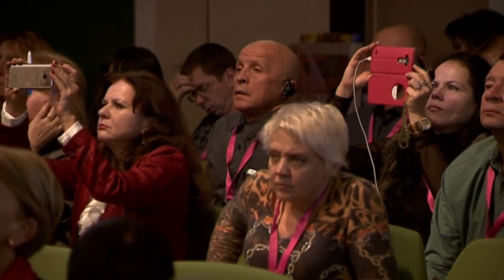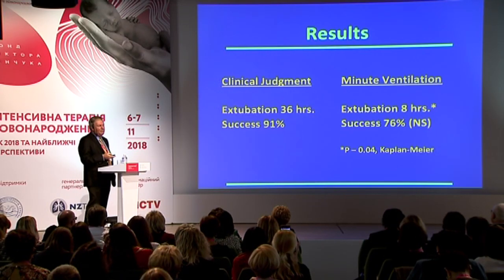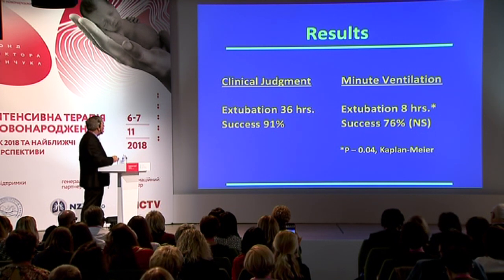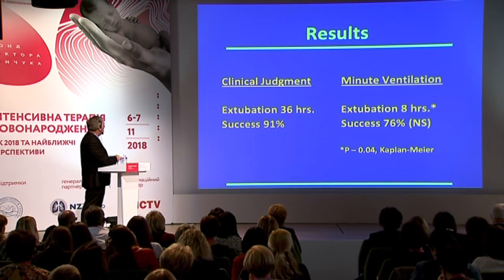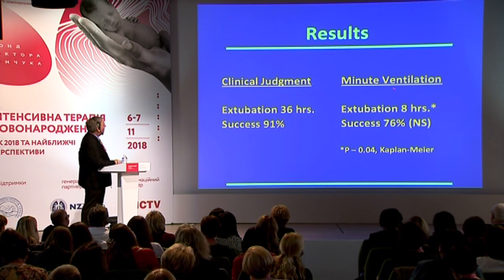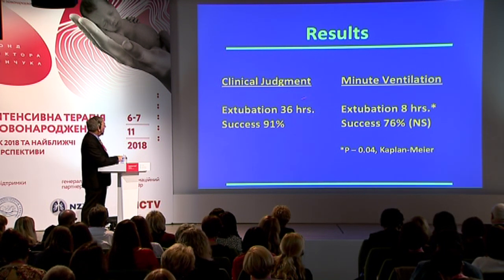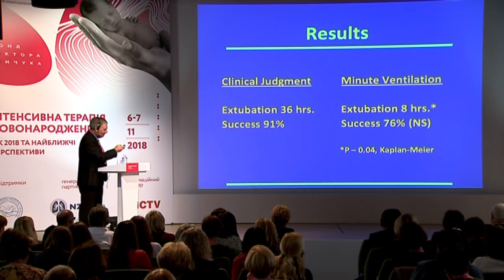And here were the results, that waiting for clinical judgment, in other words, you feel like the baby is ready for extubation, took 36 hours. Had a good success rate of 91%. By utilizing this minute ventilation trial, the average time to extubation was only 8 hours, and that difference was statistically significant. The success rate here was a little bit lower, but that difference was not statistically significant.